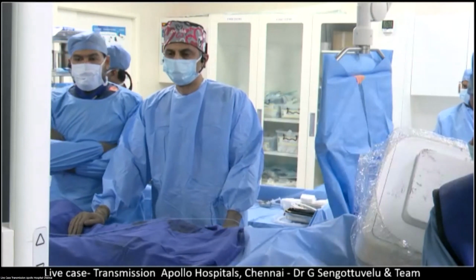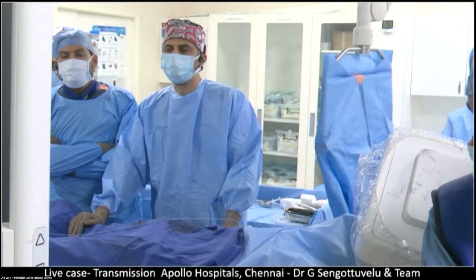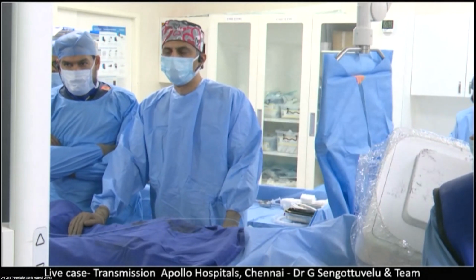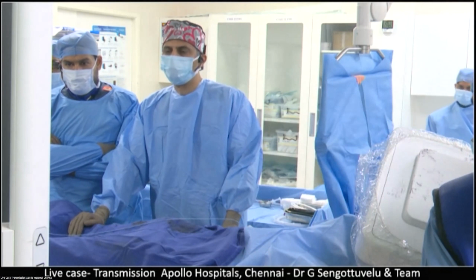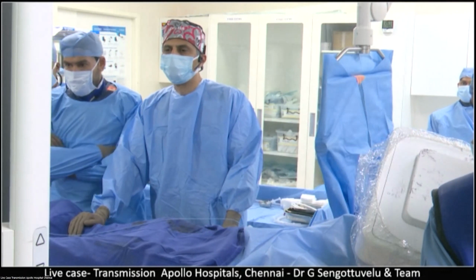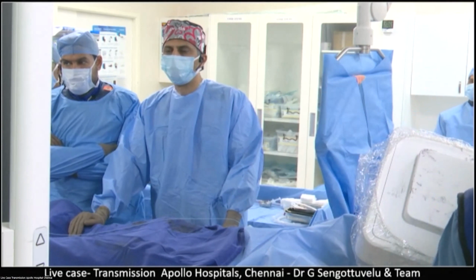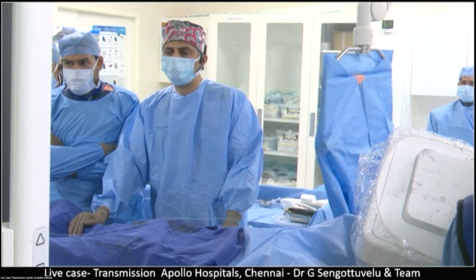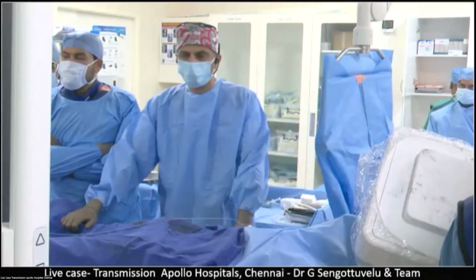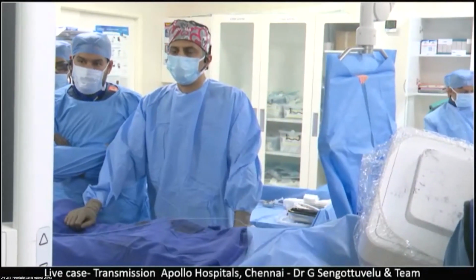I think the accesses are good. It's a bicuspid type 0. The coronaries are protected, so I would not have to worry too much about that. There is calcium. I could use any of the valves, but it's 23.5, so you could use either the self-expanding or the balloon expandable. I wouldn't really worry about that in this patient. I would predilate because it's a bicuspid with calcium, and I would just use a Safari wire to implant this. I don't think we'll have too many issues.